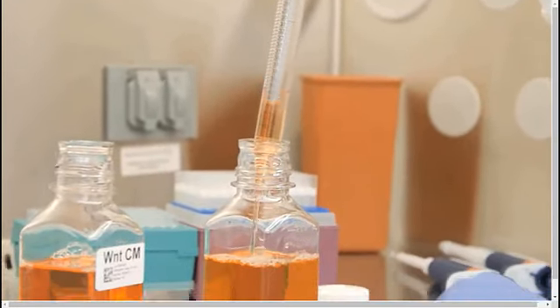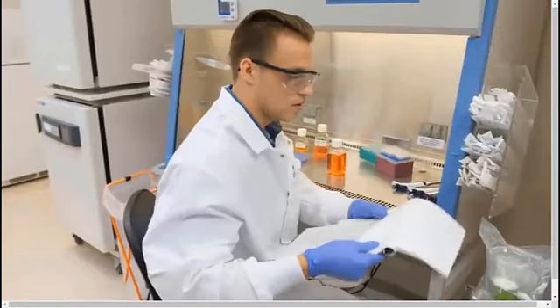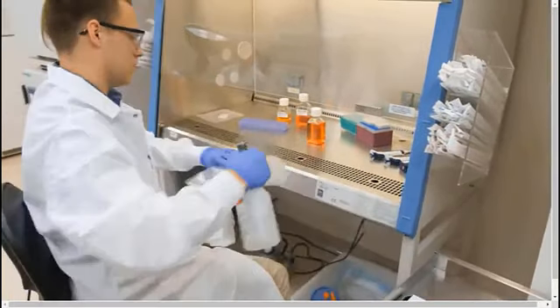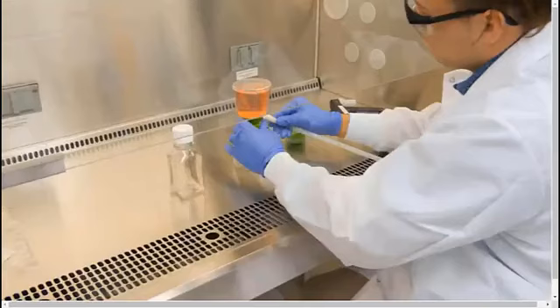Conditioned media provides a highly active source of some recombinant proteins that can be essential for organoid culture. The final growth media can be vacuum filtered, such as by using a 0.22 micron bottle top vacuum filter.